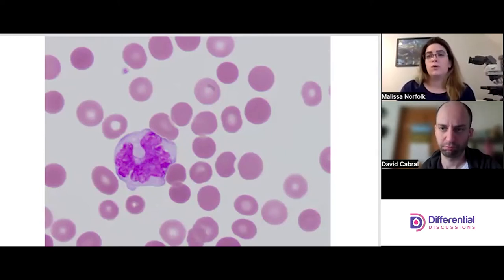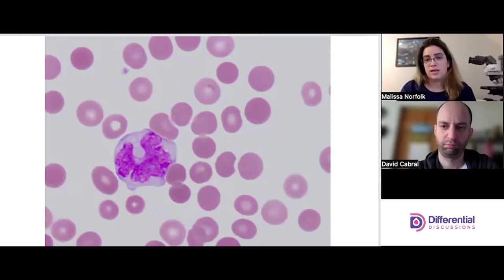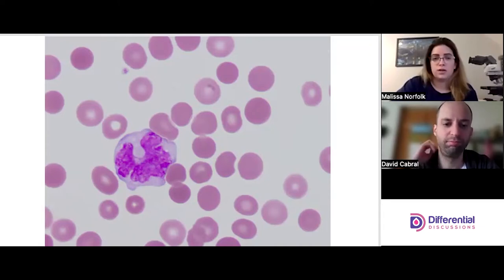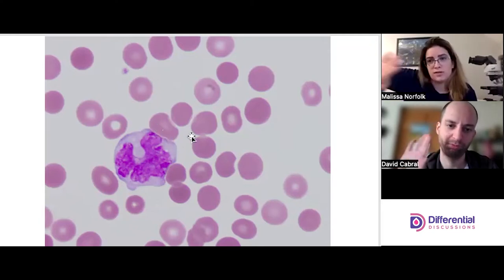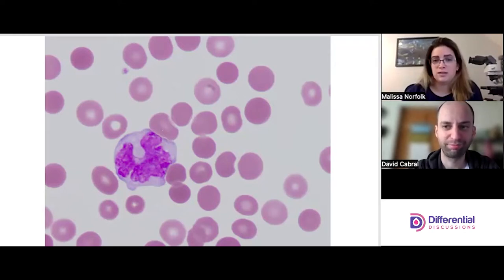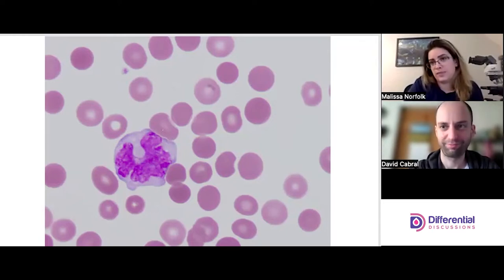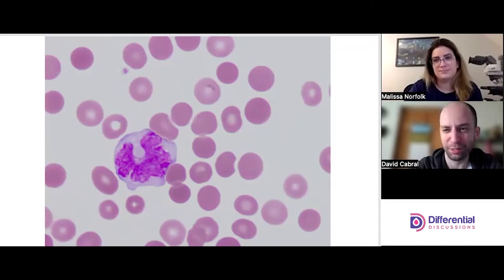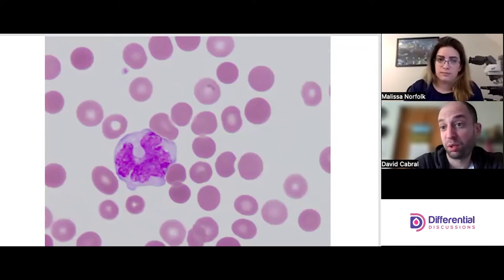Another thing — this is not always true, but frequently with monocytes when they interact with red cells around them, it looks like they're pushing the cells away rather than grabbing and pulling cells closer. If you look here it kind of looks like it's pushing those cells away. Also the cytoplasm color of the mono is the same throughout — a big clue. The fact that it's not a deep rich blue is giving us some information.